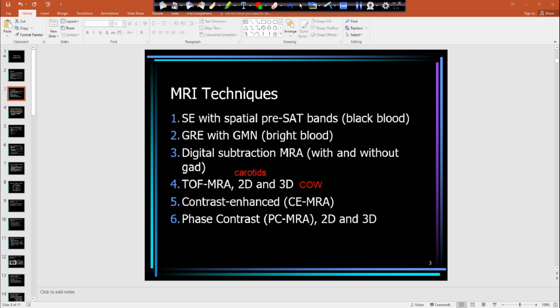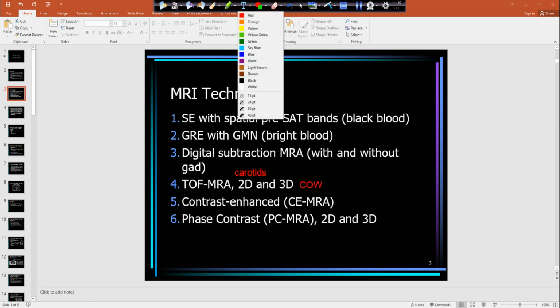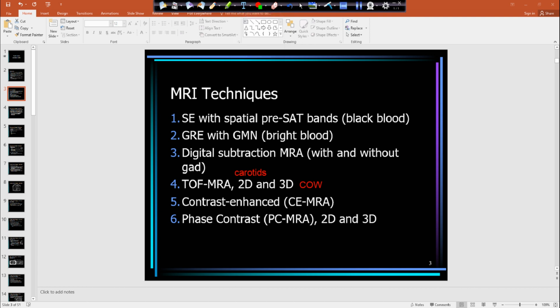And then finally, we'll talk about phase contrast MRA. A lot of times we're doing phase contrast MRA when we're looking at the superior sagittal sinus. So MRV sequences are usually our phase contrast. Anybody done an MRV of the head? Kiara, you're saying yeah? At the main hospital?